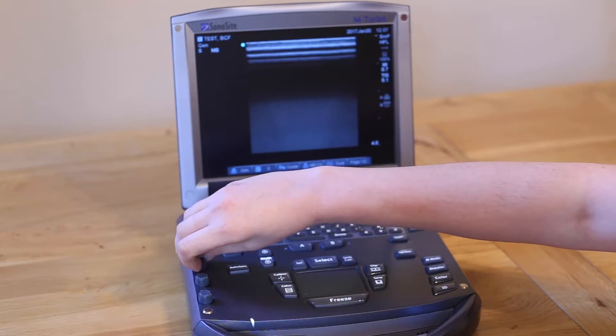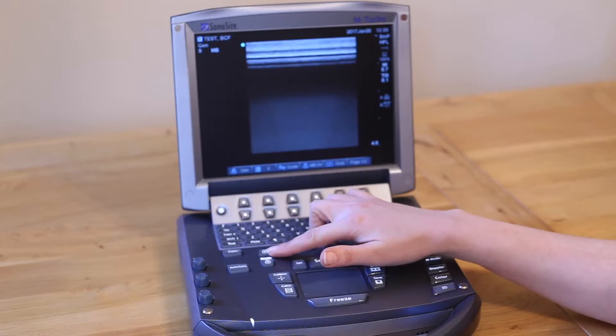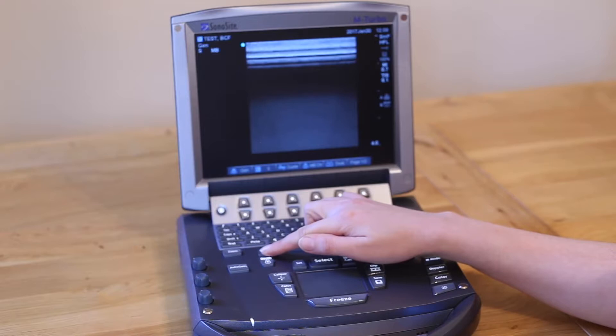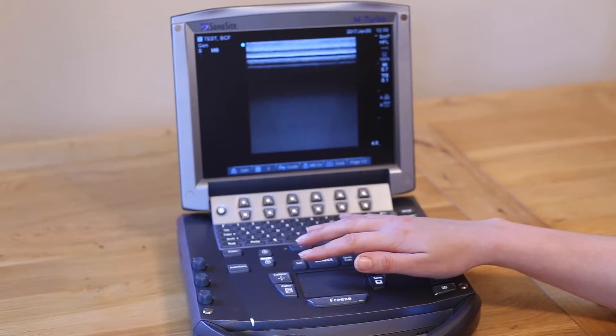To adjust the depth, press the depth up and down keys found to the top left of the tracker pad. Press the down button to increase your depth and the up button to reduce scan depth. Make sure you're not missing any information off the bottom of the screen by being too shallow a depth, and also make sure you're getting a good large image of the region of interest by not having this set too deep. There is a number on the bottom right hand side of the screen to indicate your depth in centimetres.